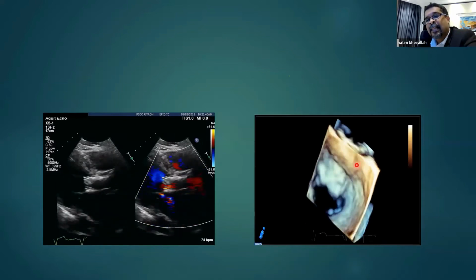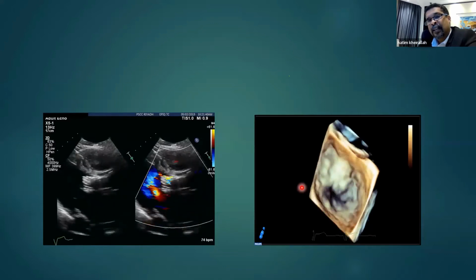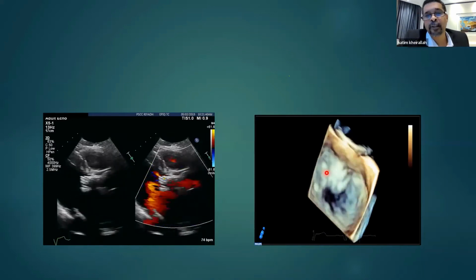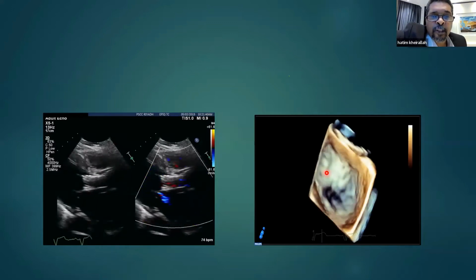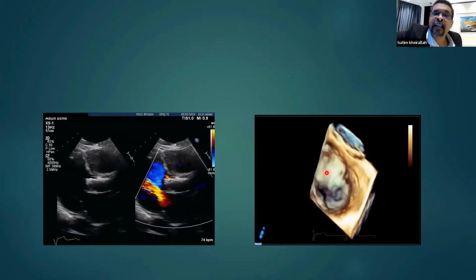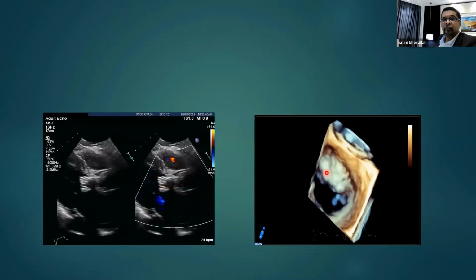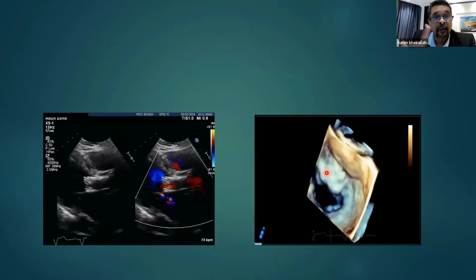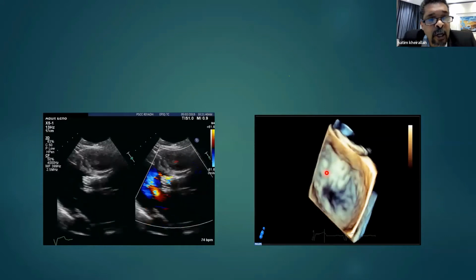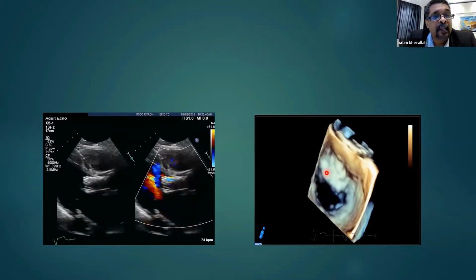If you see the 3D here, I'm showing it to you. You see the anterior leaflet is here, the posterior leaflet is here. See, the anterior leaflet is not contributing to opening anymore because the valve is encroaching upon or impinging upon the anterior leaflet, keeping it semi-closed. Okay, so that's the problem of a low-seated TAVI valve. Paravalvular leak on one side, and it might encroach upon the integrity of the mitral valve, in particular the anterior leaflet.